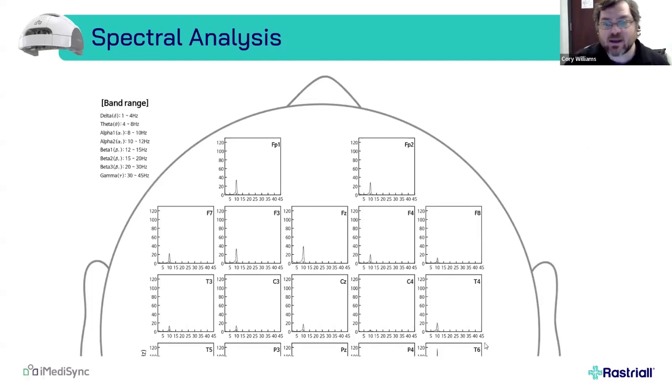Now, this is from the iMediSync software. And what you can see here is where activity is peaking and where it's highest in a given frequency range at a given sensor. So looking at this head, we can see at FZ, the alpha is higher than in all the surrounding sensors. And high alpha in FZ can be a marker for depression or OCD or anxiety. Shari will talk more about clinical presentation, but that's helpful for us as clinicians to know.